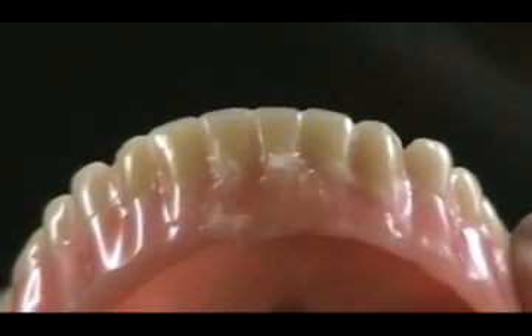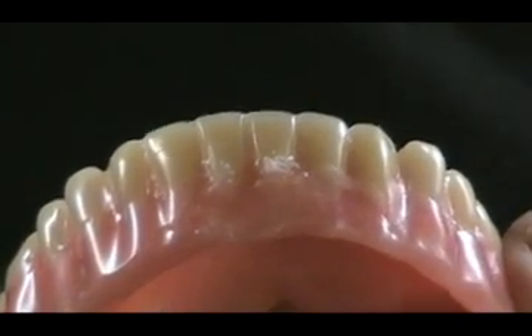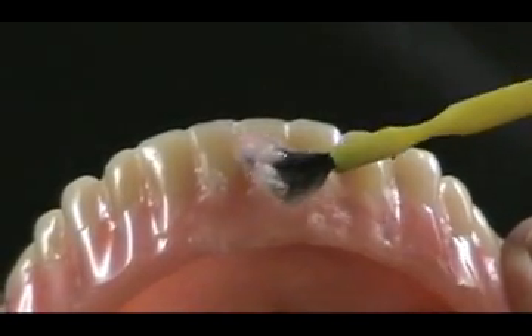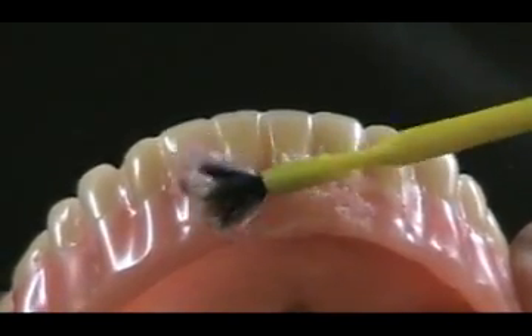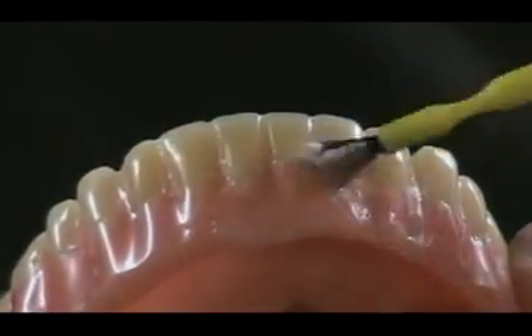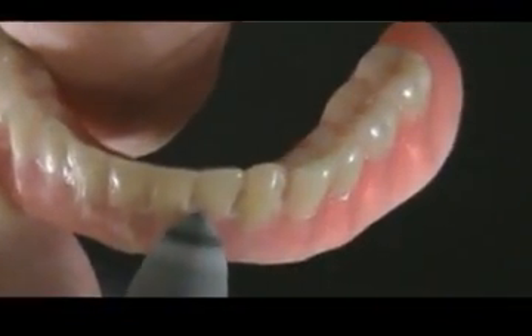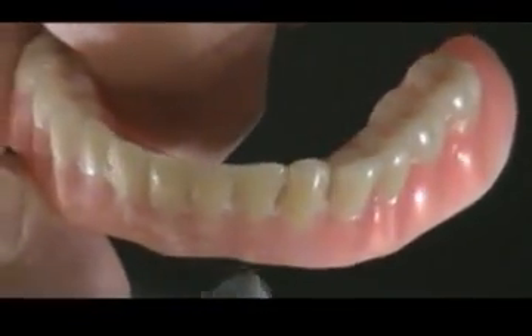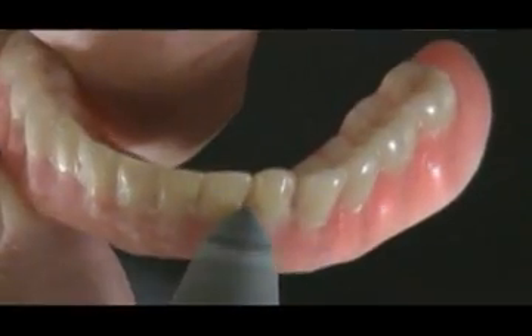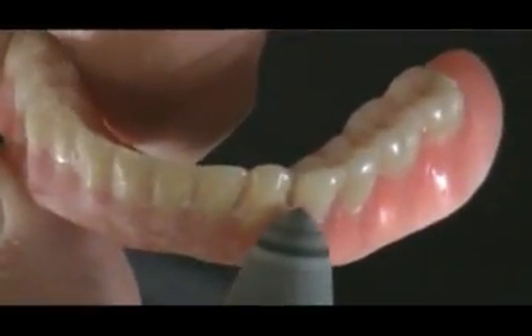Place the second layer of Permamesh over the first layer to provide adequate bulk and strength. The Permamesh is super-saturated with monomer from the thin slurry mix. Use a brush to add powder and create the proper contour of the denture. Polymerize the self-cure resin in a pressure pot with warm water. Remove the repaired and reinforced denture from the pressure pot and adjust the Permamesh and acrylic to proper contour with either a silicone cutter polisher or acrylic burr.